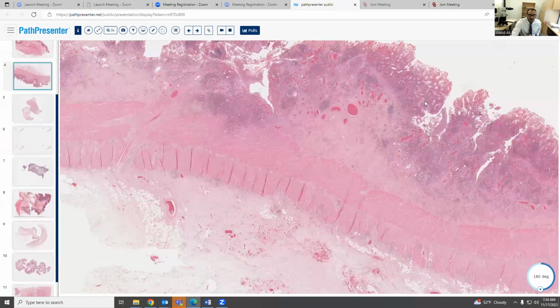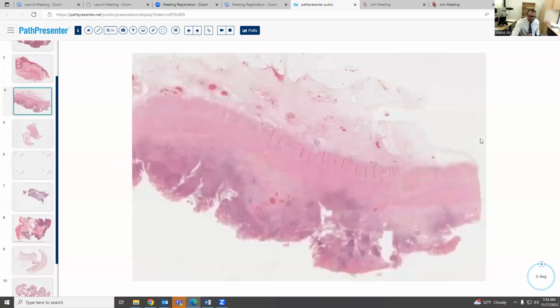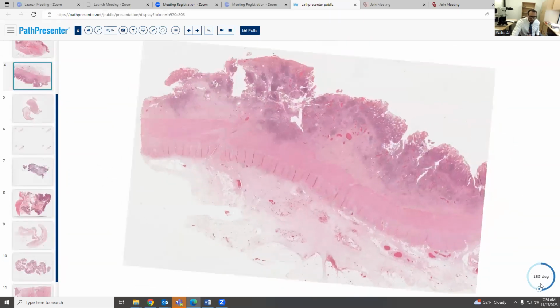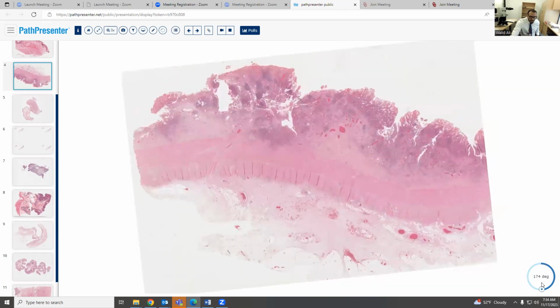Usually they call it transmural inflammation. So this is a very good feature, a difference that can help you differentiate. We can compare, right? Look at this. There are no inflammatory cells here, but here there are inflammatory cells going deep to the muscularis propria.